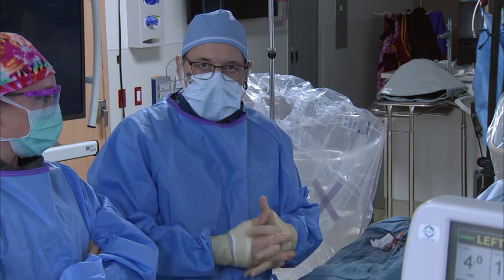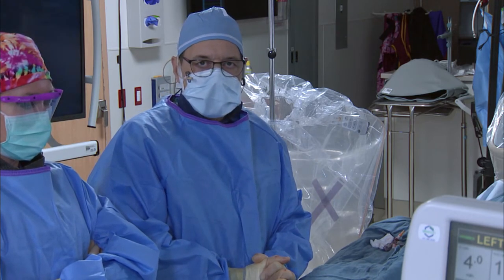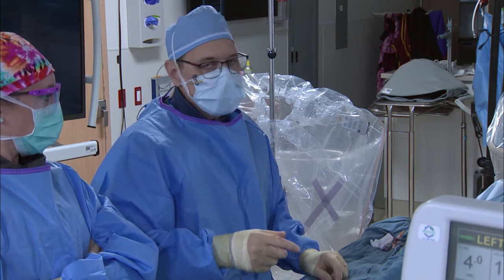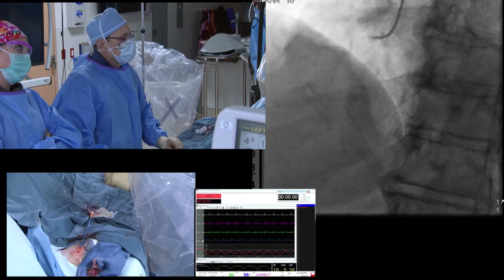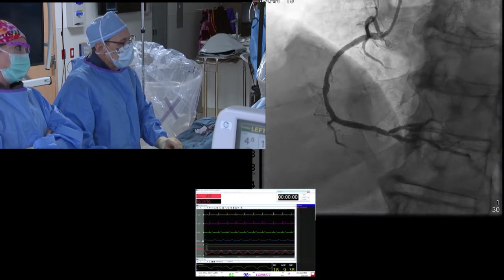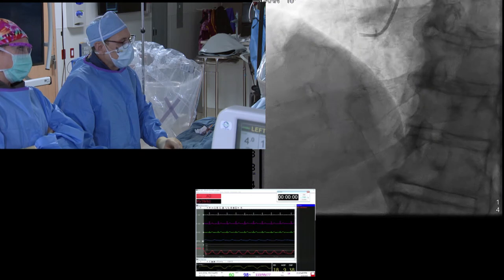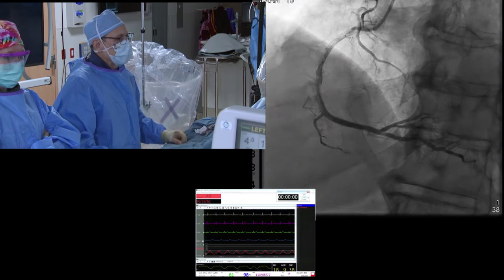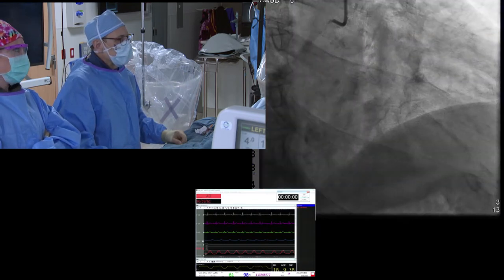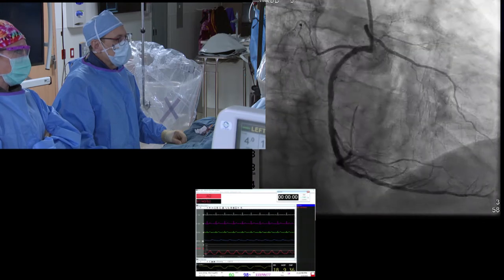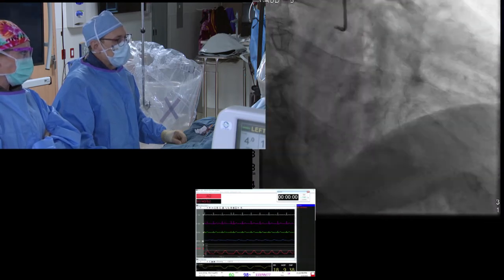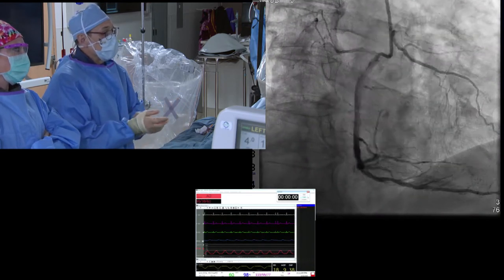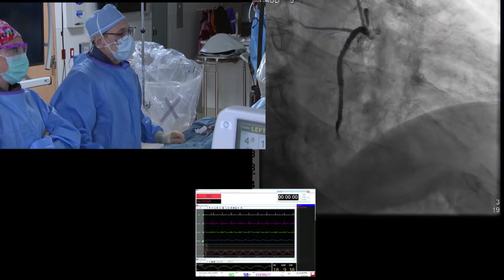Now we've done our diagnostic procedure. Let's go through the films. This is the right coronary — you can see a little bit of disease at the ostium of the posterolateral branch. What is striking on the RAO imaging is you see septal collaterals going up, not quite reaching the stented segment of the LAD, but it does suggest there is some disease of the LAD.